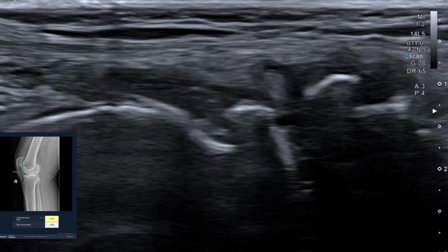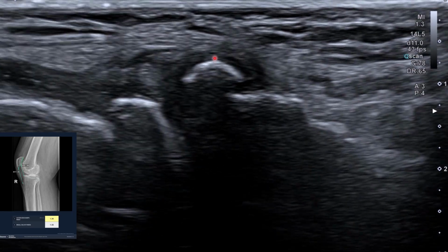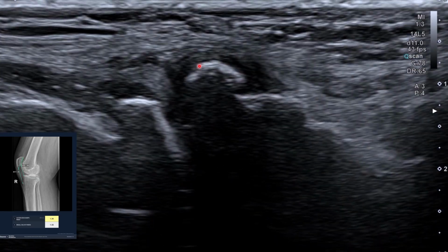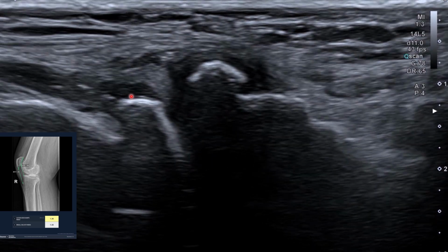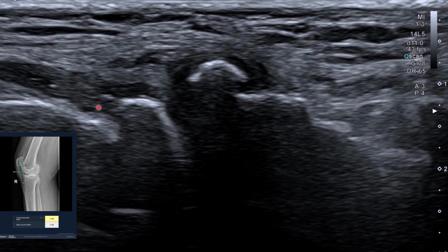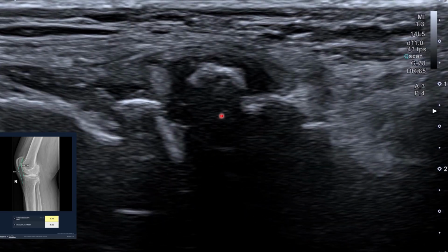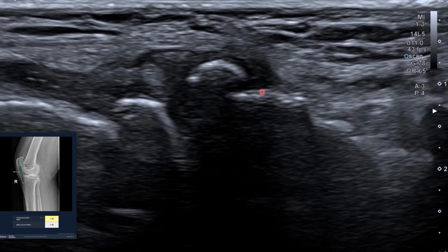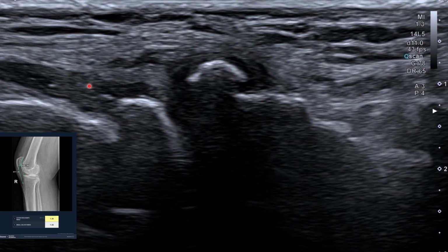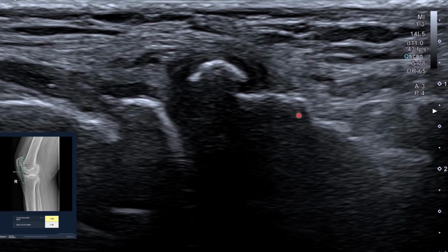That's the knee. So this is the left knee and the lateral aspect. So see what is there. You can see these are free loose bones, so these are osteophytes, and you can see there's fluid also there. So there is inflammation there that is probably caused by these osteophytes on the lateral aspect of the knee.